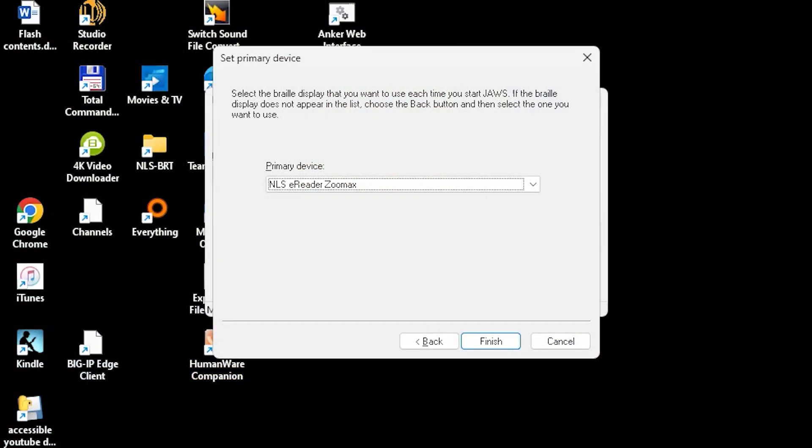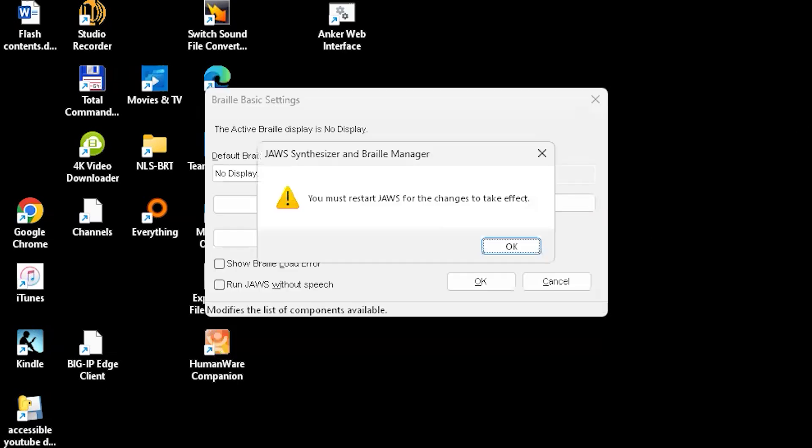Next, you will be asked to select the output port for the NLS eReader ZoomX Braille display. Select USB, then Tab to Next and press Enter. Next, you will be asked to select the Braille display that you want to use each time the computer starts. Arrow to NLS eReader ZoomX and Tab to Finish. Press Enter on Finish. You will be prompted to restart JAWS. Press Enter on OK and restart JAWS.